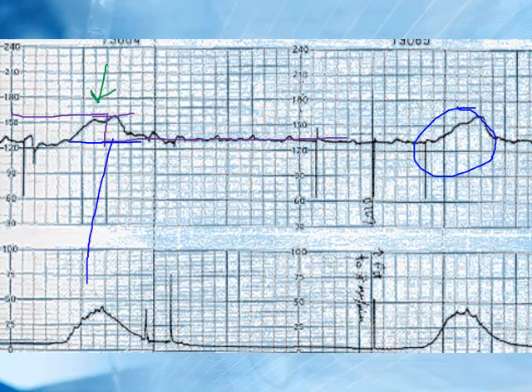They're happening right with the contraction. You see down here, we always pay attention to the contraction. And that just means that baby's doing really well. It's tolerating these contractions beautifully. It gets squeezed, it says, woo, my heart rate goes higher. Beautiful baby. What would you say about the variability here?